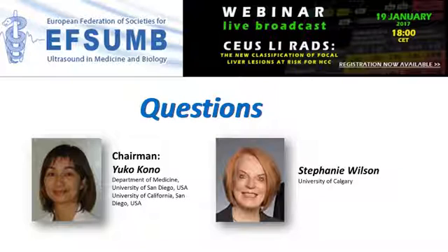With Definity, we do multiple small injections of contrast. With SonoVue, as it's marketed in Europe and in Canada, and Lumason now in the United States, the quantities are quite different. Perhaps Fabio might speak to that in just a moment, but I'll speak to the other part of your question.